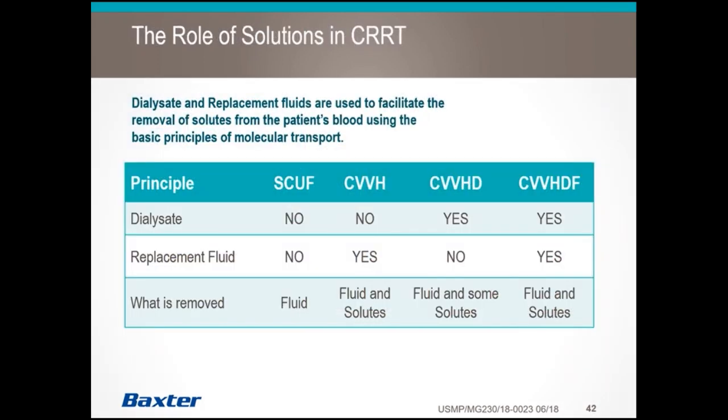So the role of solutions in CRRT: the dialysate and replacement solutions are used to facilitate the removal of solutes using those basic principles of molecular transport. Just to review that in slide format, when you're doing SCUF therapy, there's no fluid administered on the machine. You're just pulling patient fluid off. You're solely pulling fluid off of a patient.